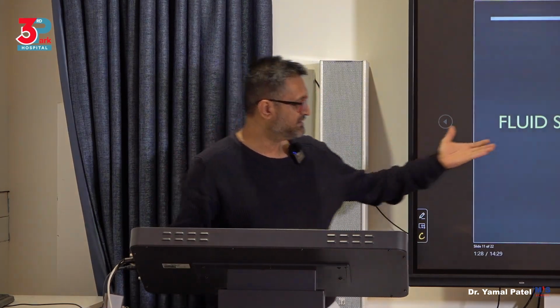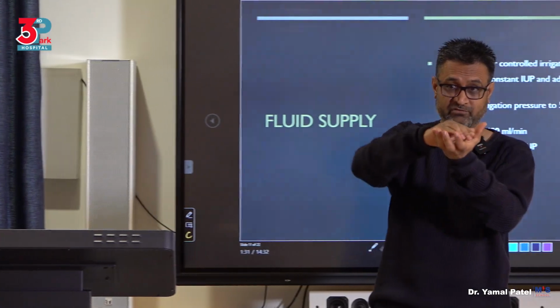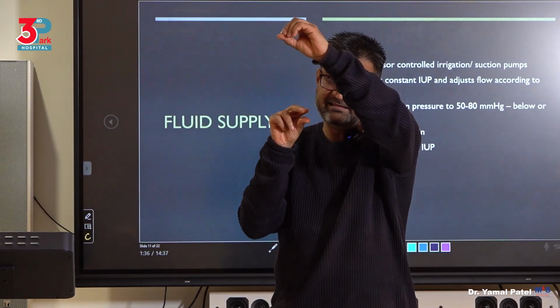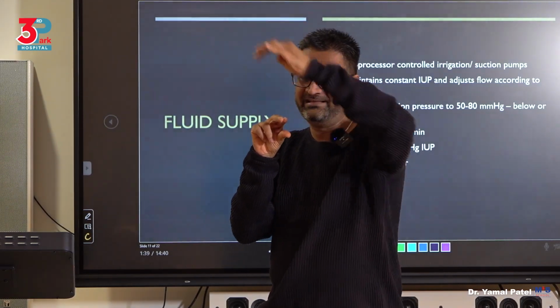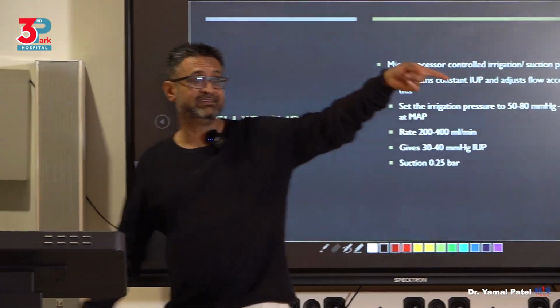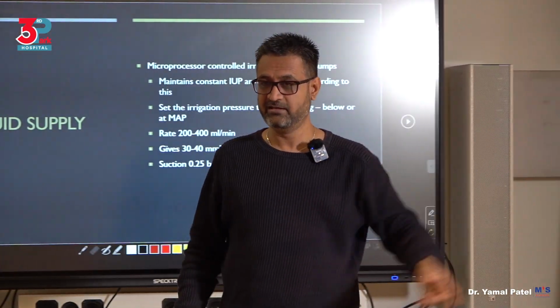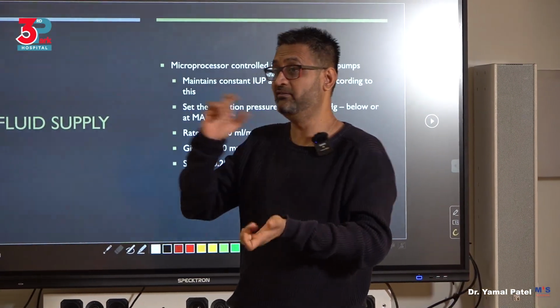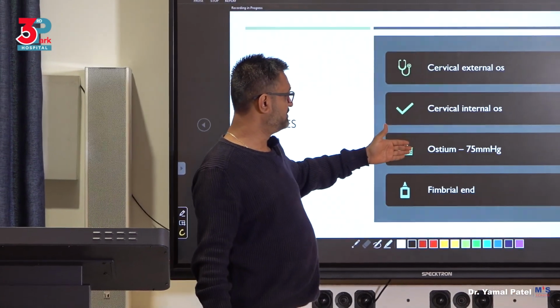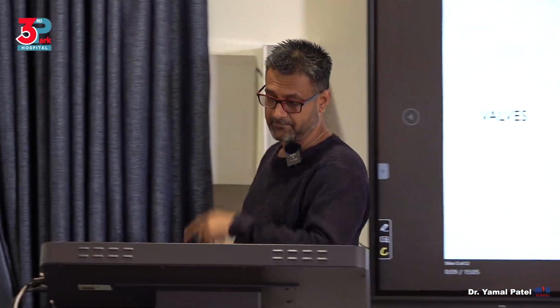So you should try aiming at 30 to 40 millimeters of mercury intrauterine pressure to give you a good distension. So remember the internal os and then the ostium. So 40 to 70, if you keep it between there, and that's what this pressure will do. When you say I'm setting it at 100, it doesn't mean it's giving you 100, but it's going to keep it below 100. It's the maximum. You've understood? So this is what you will be setting. So these are the valves I was talking about: the external os, the internal os, the ostium, and the fimbrial end, right?